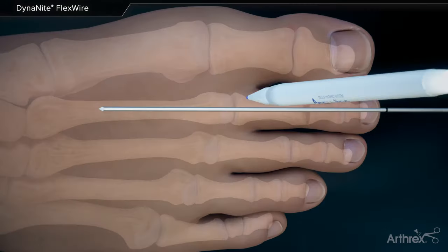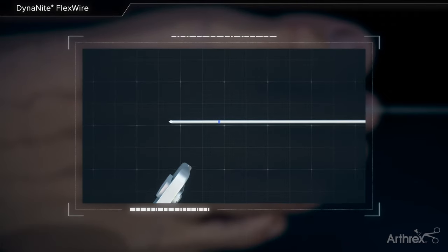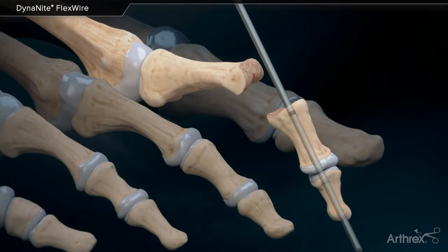The surgeon then marks the desired endpoint of the wire. Using wire cutters, the wire is cut at an angle to create a beveled tip to ease implantation. Advance the malleable portion of the wire distally through the middle and distal phalanges.